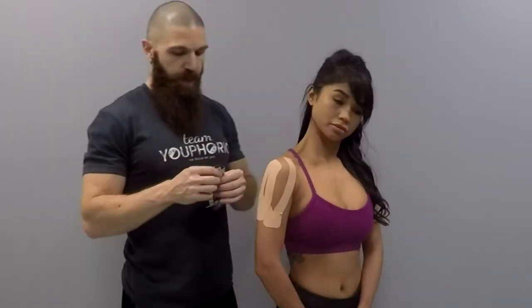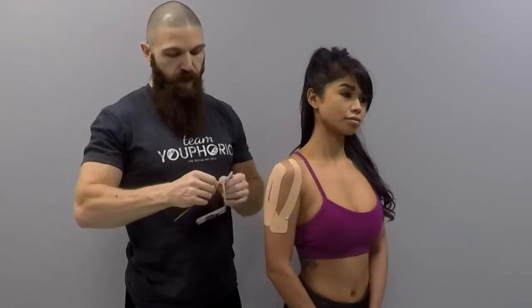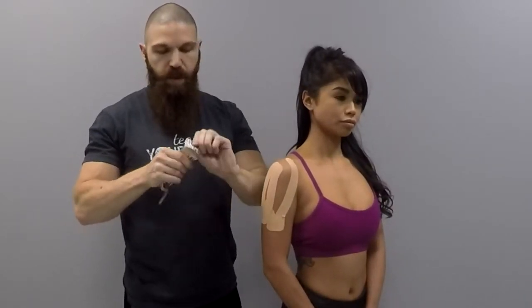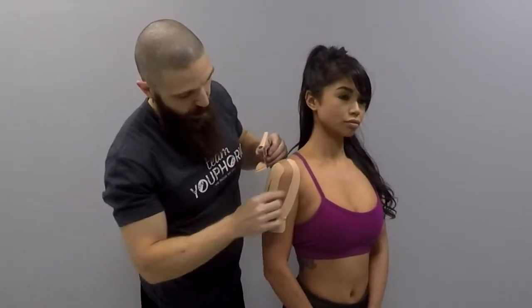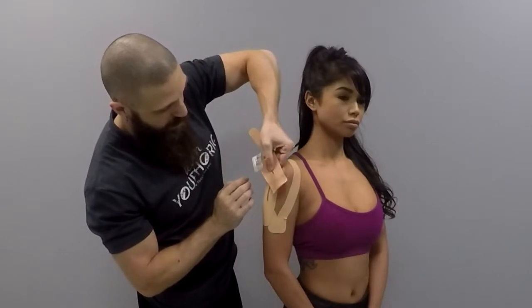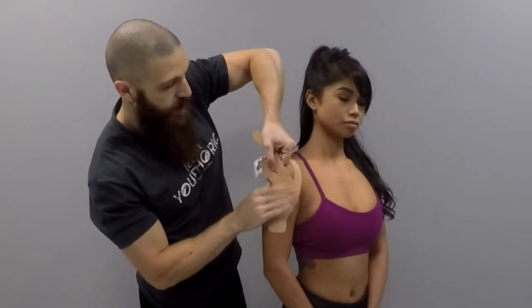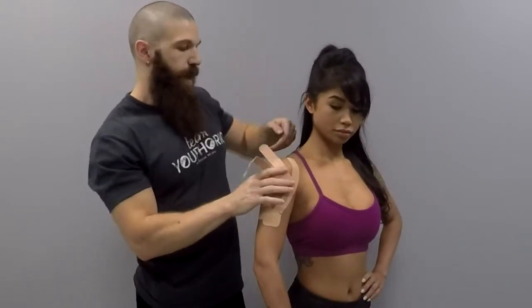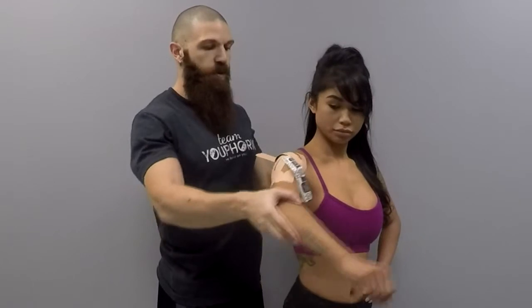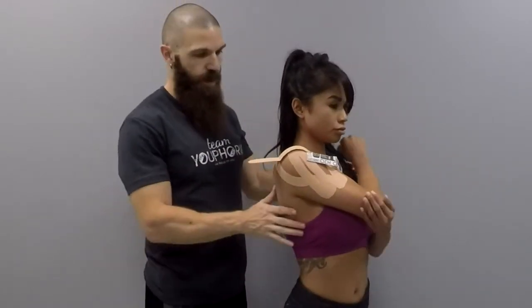For your second Y-strip, tear the edges off. Place it right in between the I-strip with the slit and the Y-strip, on a bit of an angle. Apply the base and rub to activate the adhesive. Then have the client turn and hold their arm to their chest.